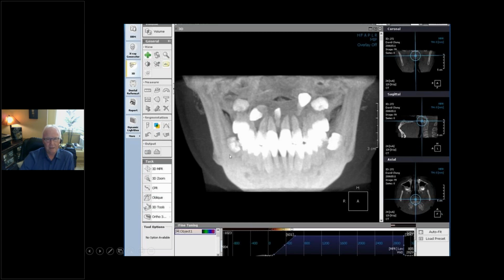Now this is made in this fashion for showing calcifications, and I'll show you another couple screens of why that's important. But there's not a lot of information here. There's just information that you'll go, I can't do this case by myself. I need an orthodontist and an oral maxillofacial surgeon by my side doing this case.